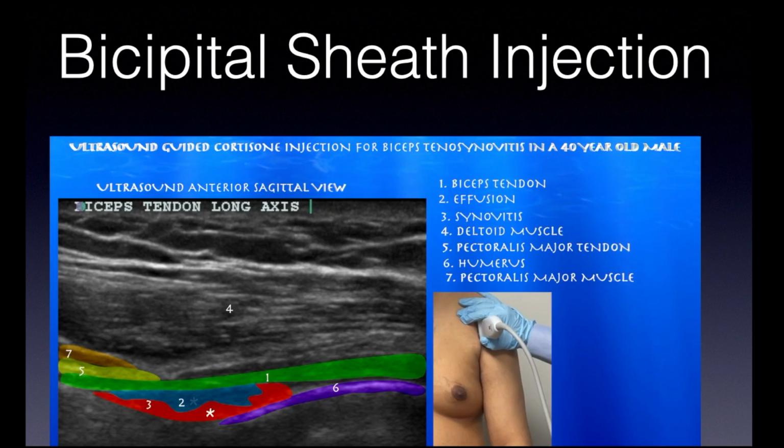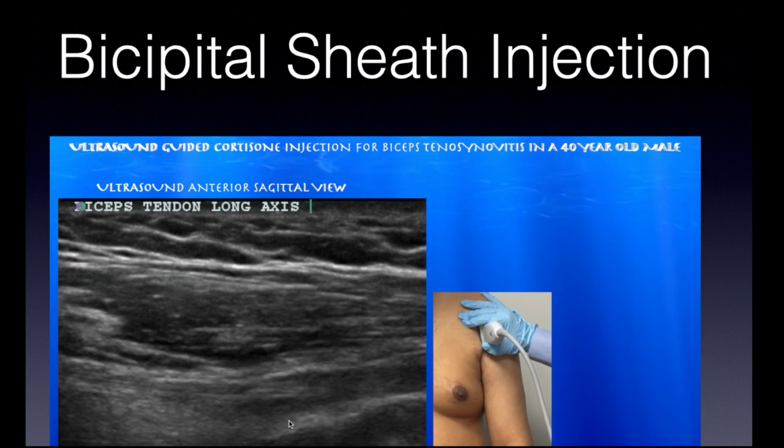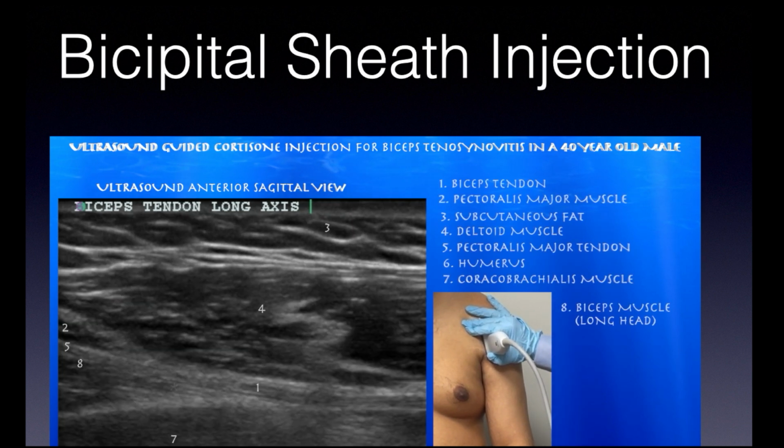So I'm just going to jump to the procedure for time's sake. Again, it's fluid, biceps tendon, some synovitis, and he was focally tender right over the biceps tendon. I think that was really my main reason for doing this procedure.